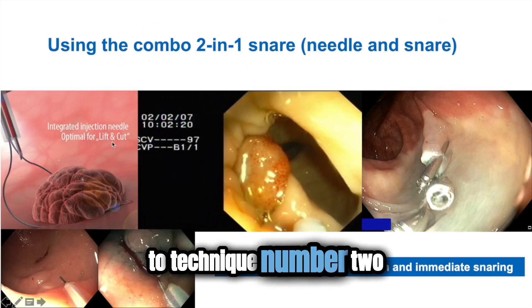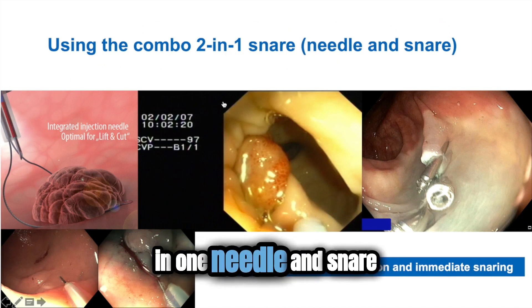Now we go to technique number two. Look at this — combo two-in-one needle and snare.